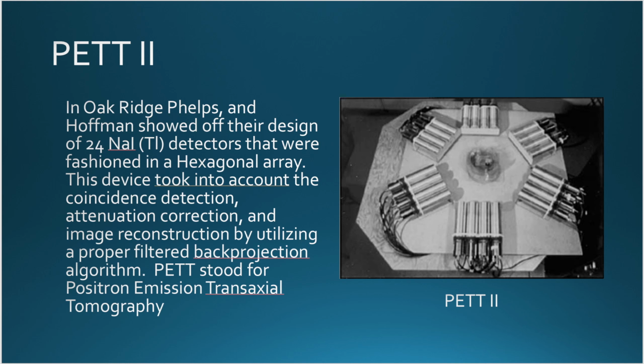PET stood for positron emission transaxial tomography, later changed to PET instead of PETT since they removed the transaxial part of this device. On the right, we can see PET-2 and look at a brief model of what their idea was.